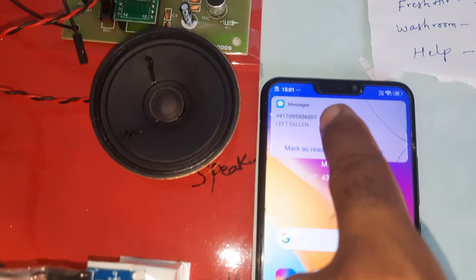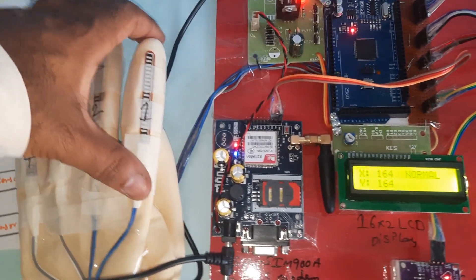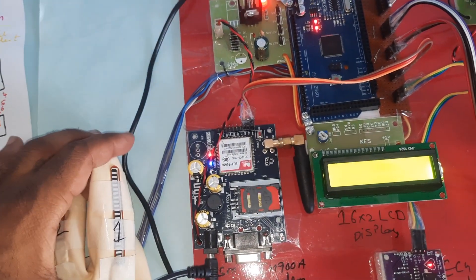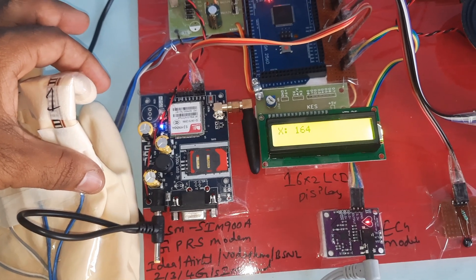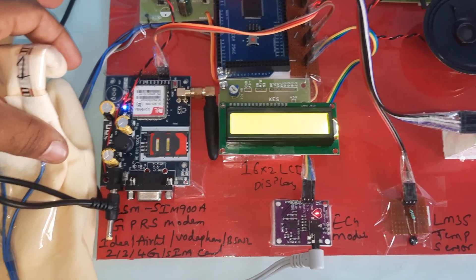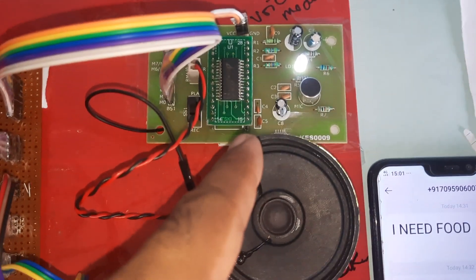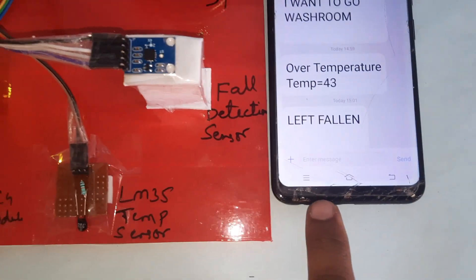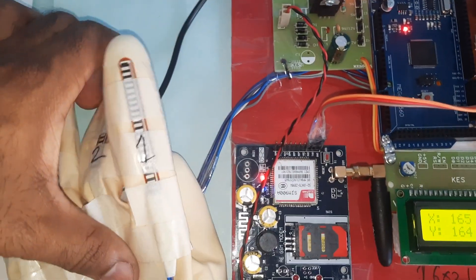Now going to the finger flex sensors. First finger bending — the system sends an SMS alert saying 'water.' Second finger bending.